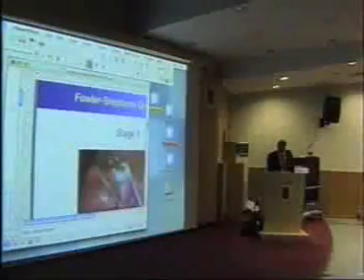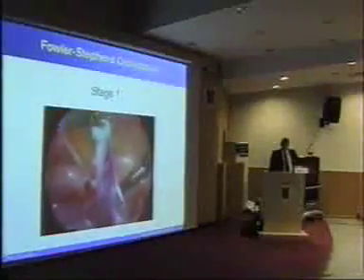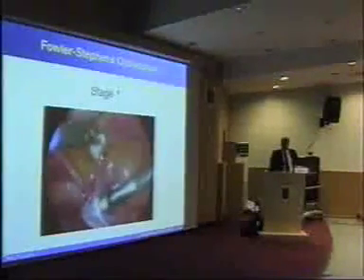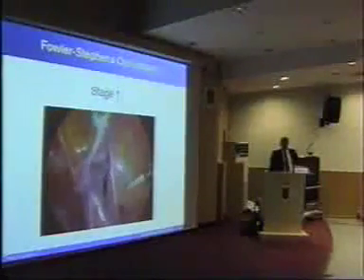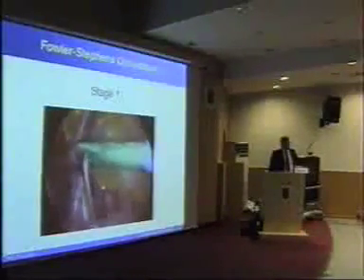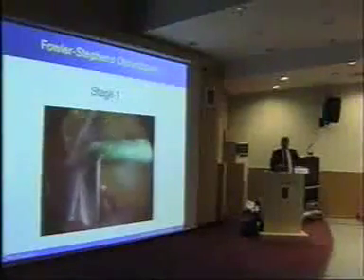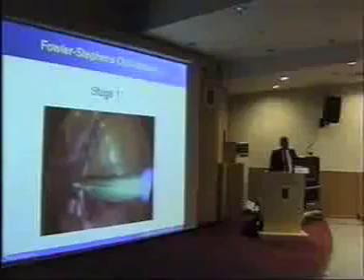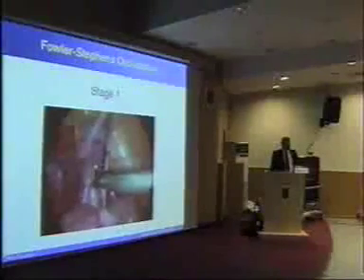Well, let's see what I did, shall we? I mean, here you can see the vessels here and the vas here, and I'm at least 3 centimeters above the testis. You see these vessels here? I want to preserve them. So I'm actually ligating proximal to those. The closer to the testicle you are, the more of the accessory blood supply you're going to compromise. And you want to aim for a strip of peritoneum which is about 2 centimeters wide. So you want to stay at least 2 centimeters above the testicle when you do it.